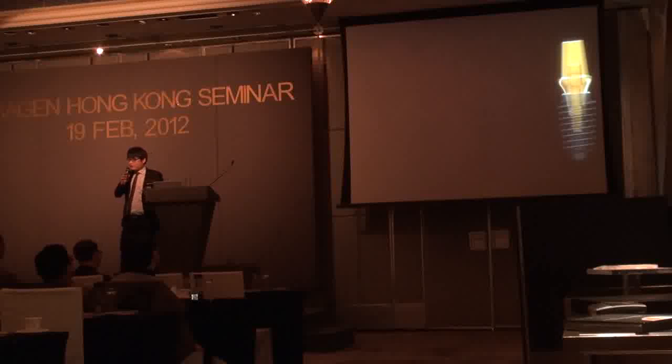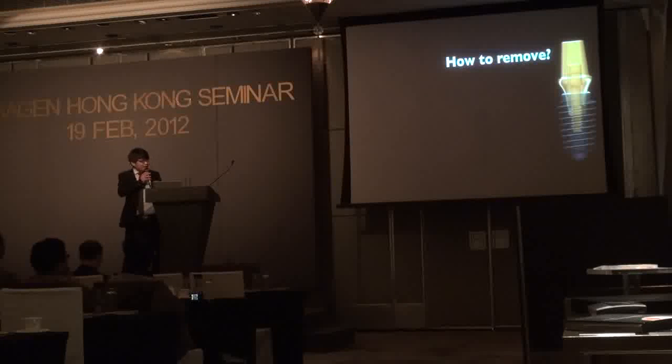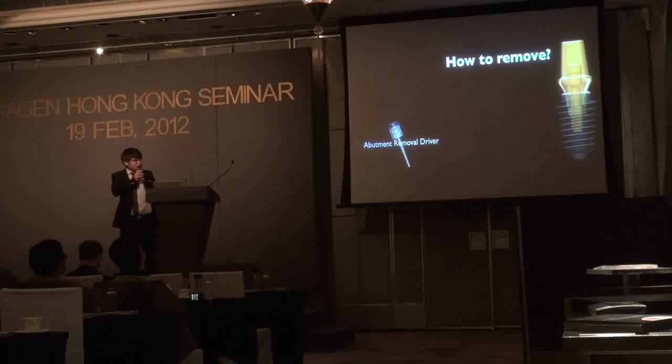But some dentists ask, how can we remove the abutment? If we cannot remove the abutment, it will be very difficult. Normally, of course, we have a special tool to remove the abutment.